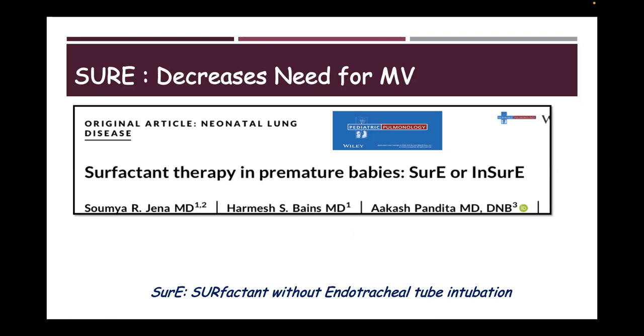We have published various publications. This is the largest RCT which we published, and we showed that with this technique, we can decrease the incidence of mechanical ventilation as well as BPD.